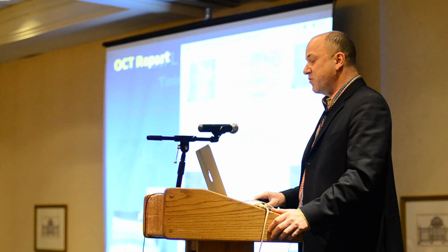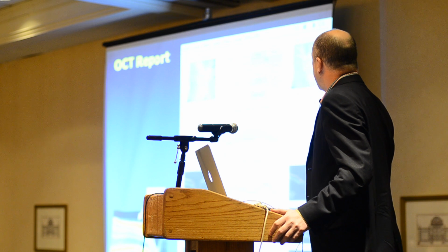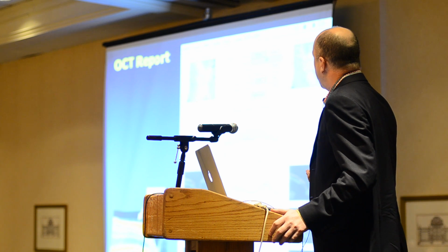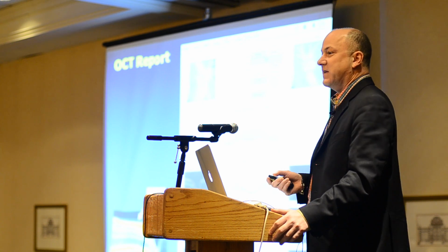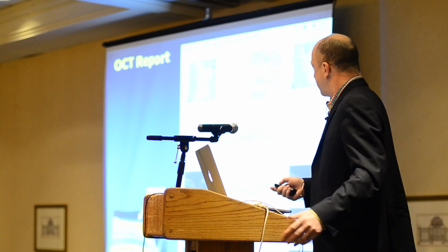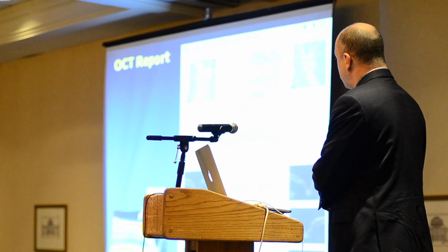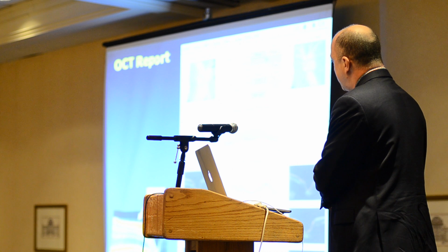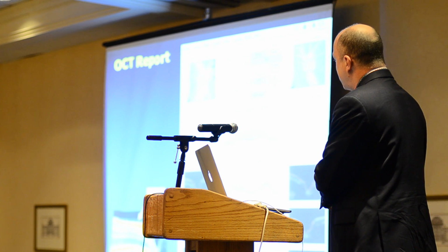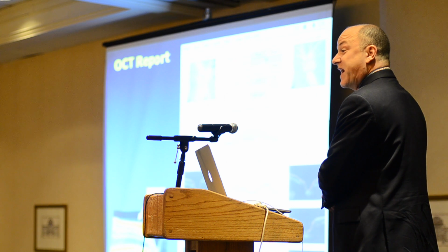But what information do we get? This is the nice sheet of paper that's delivered by the machine, and an example is a patient here with left eye optic neuritis. OD means right eye, OS means left eye. It's secret code, but now you know it. All right. This is the picture, essentially, that we're getting delivered, magnified up here, of the optic nerve as the cables are diving down here to form the nerve. And this is the area off of the nerve that we're measuring. And this is the retinal nerve fiber layer in red. That is the thickness of the layer that we're measuring.